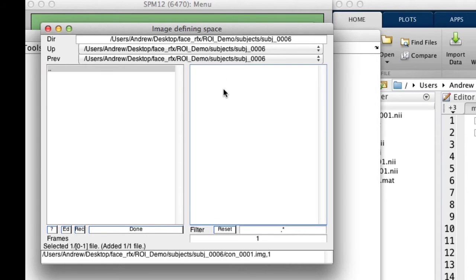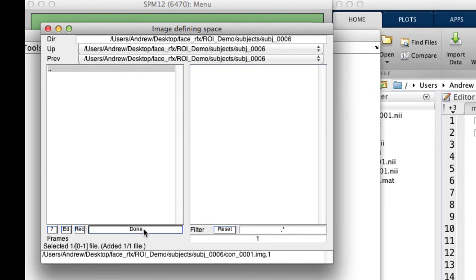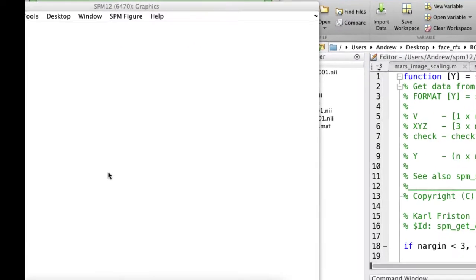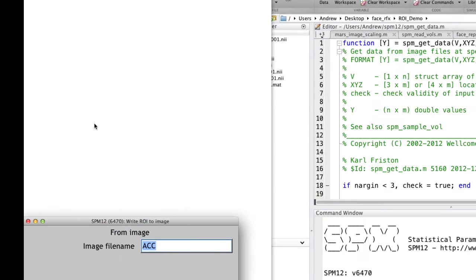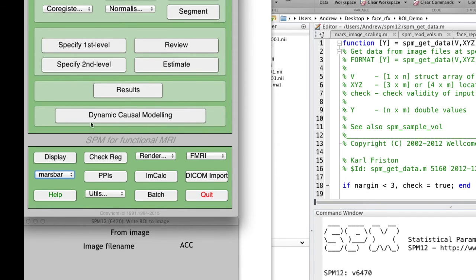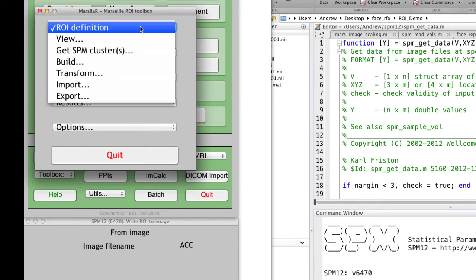Now, go ahead, select the contrast image, and then click the dot to save that ROI to the current directory. Let's call it ACC, hit return, and then select MarsBar again so that we can visualize exactly where that ROI is.